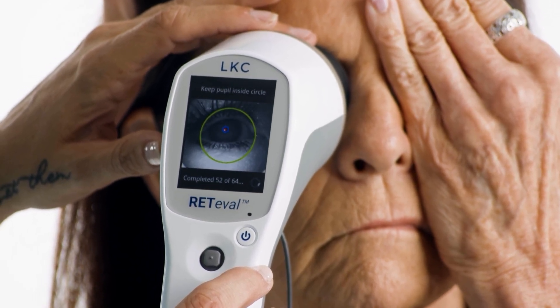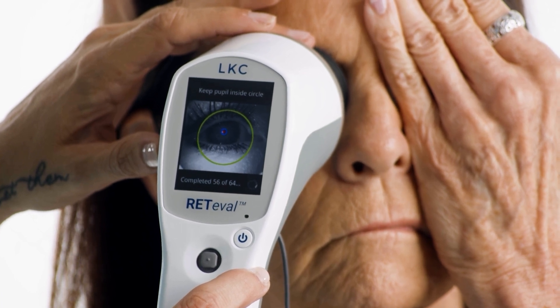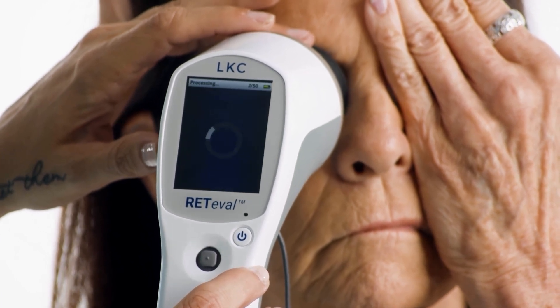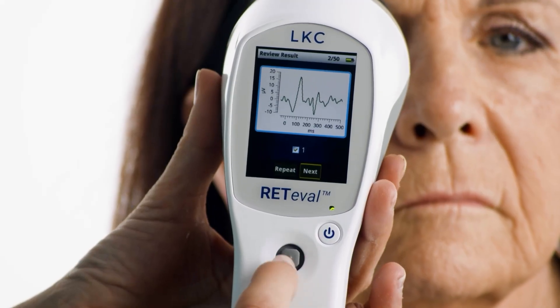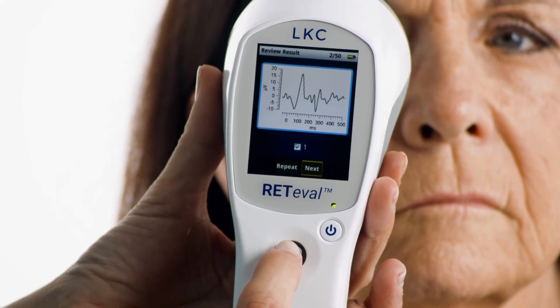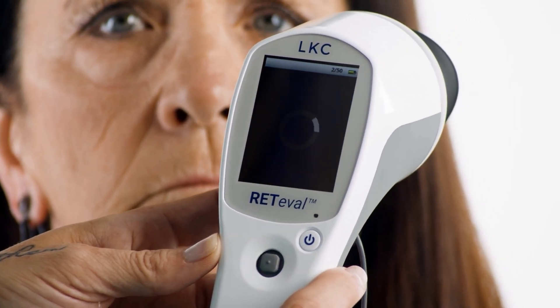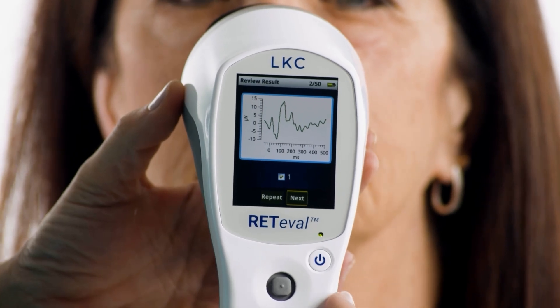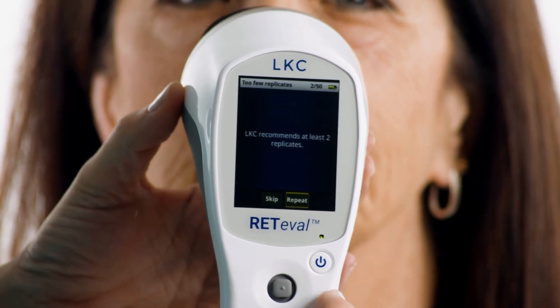You will see a counter on the screen during the test so you can let the patient know how the test is progressing. Once the device has finished collecting data, it will process it and show you a picture of the waveform on the results screen. Repeat the test so that you have two tests per eye. When you're finished testing the right eye, press next on the screen so that you can test the left eye using the same process.